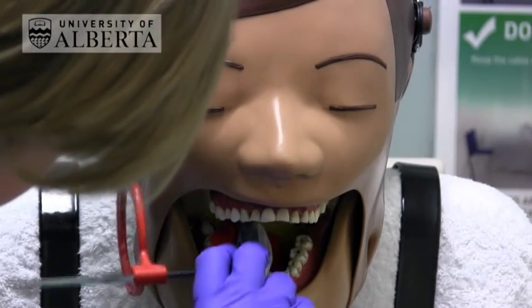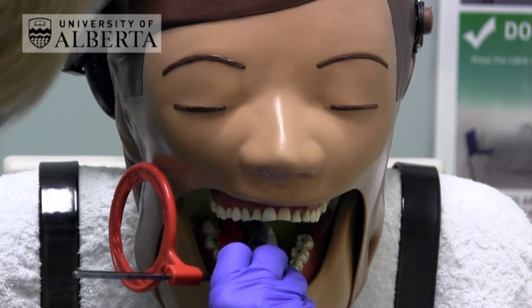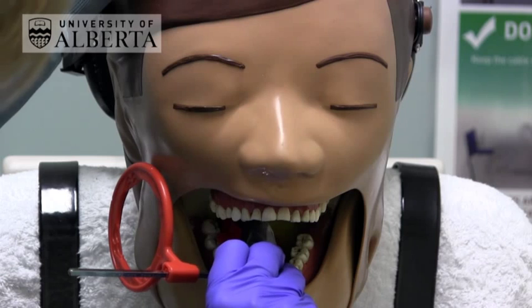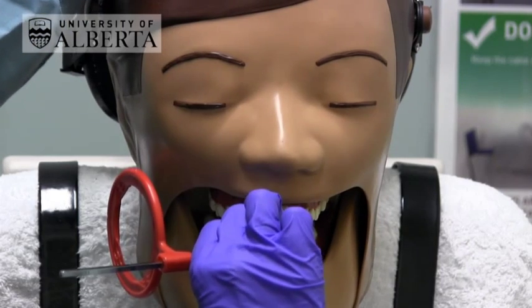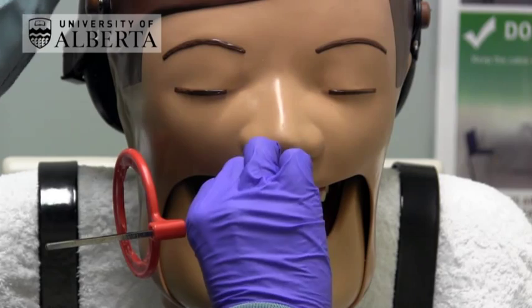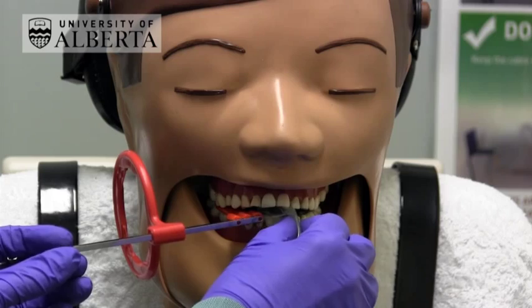For a molar view, position the receptor parallel to the lingual surface of the molar teeth. Make sure that the distal edge of the sensor is behind the most fully erupted distal tooth. Ask the patient to close gently together onto the bite block. Make sure that the full biting force is on the bite block and not on the cable.